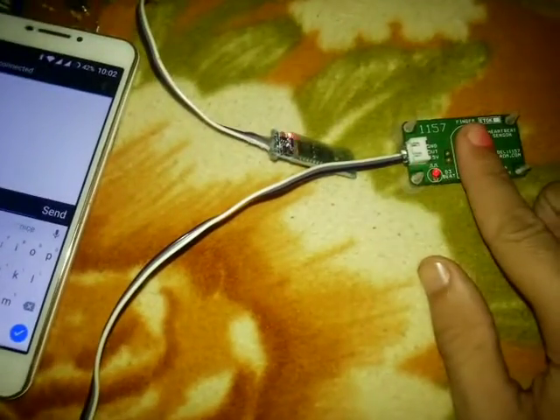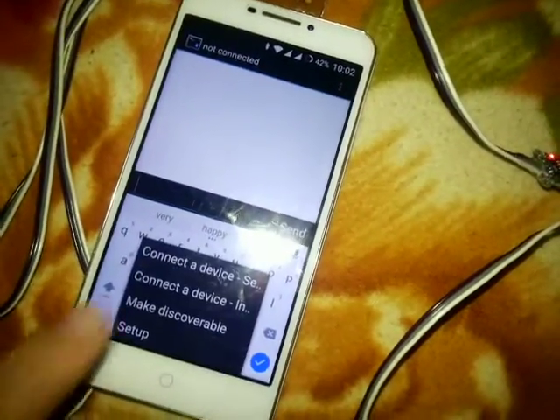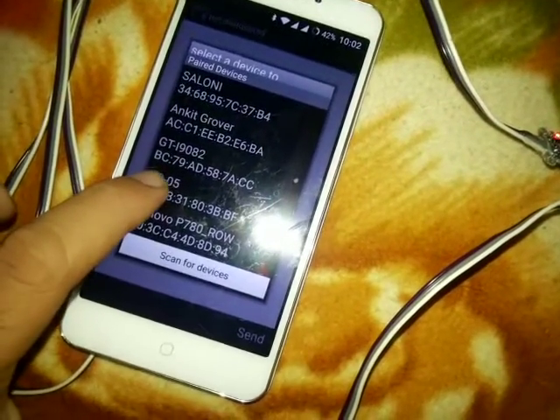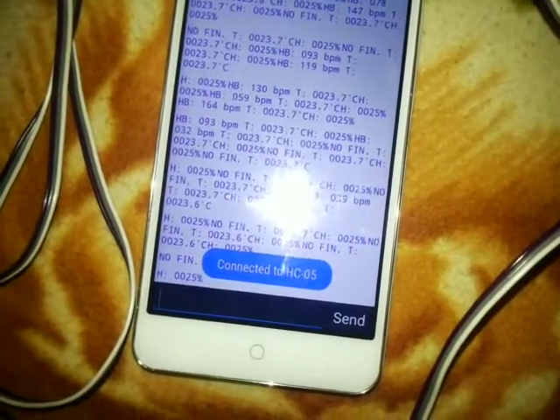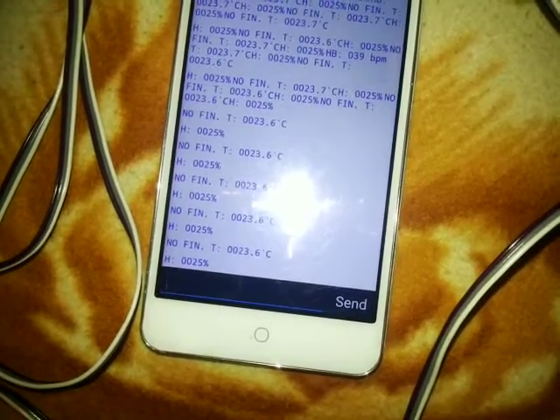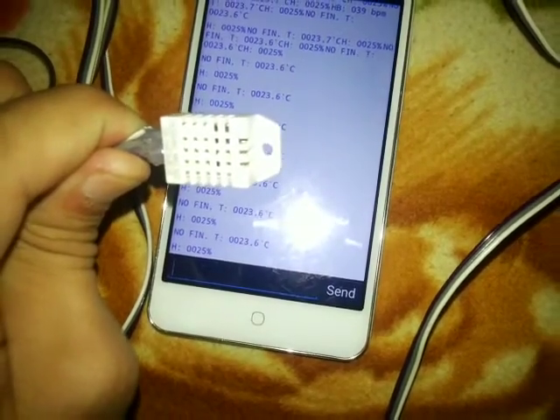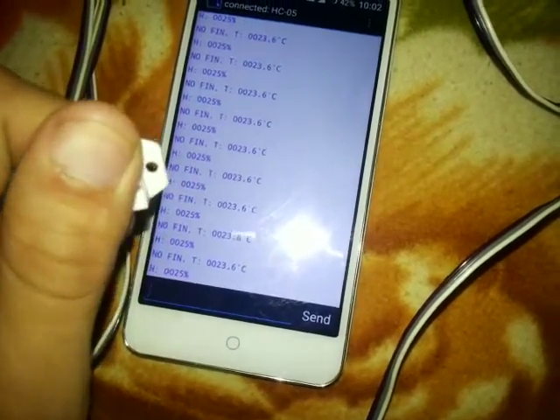We'll put the finger onto the heart rate sensor when we need it, but first we'll connect with this device. The name of the device is HC-05 and we'll connect it. The previous data will be displayed, which is showing 'no finger' and the temperature value as well as the humidity value.